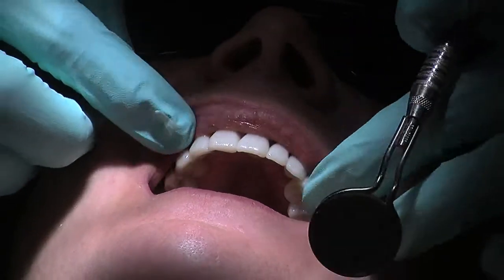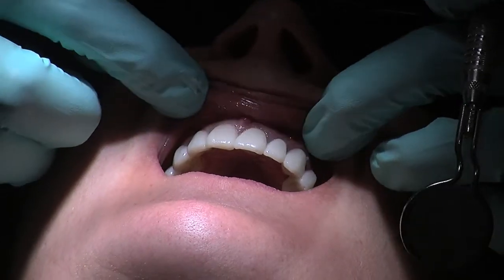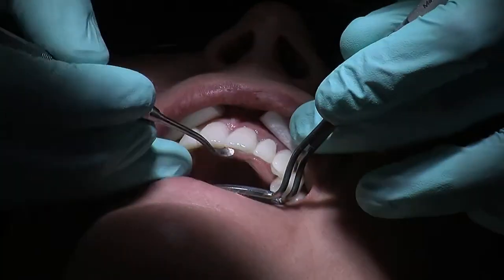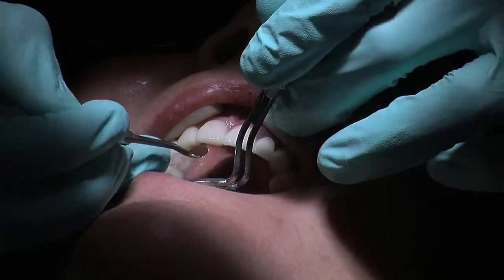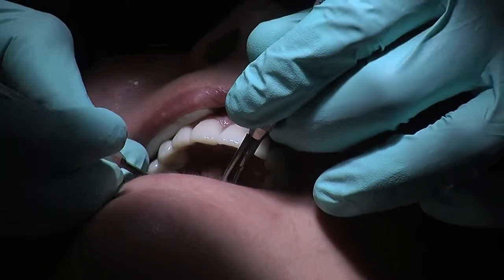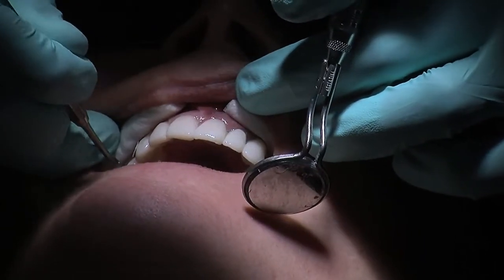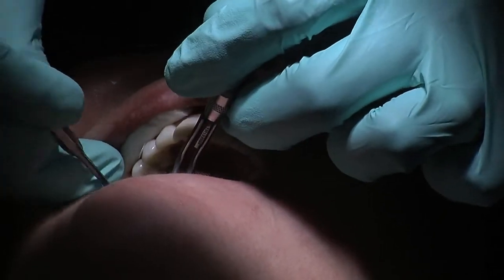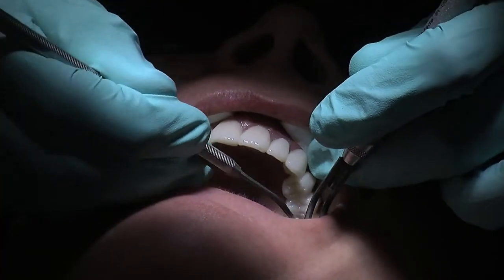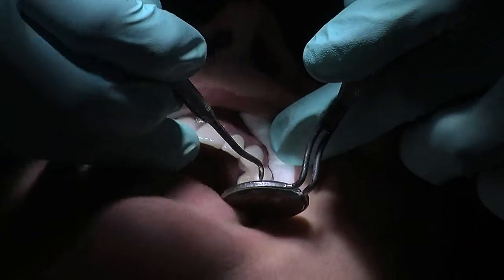Wax ups were excellent, and you can see now my work is going to be absolutely minimum finishing these off. So I've got a Mitchell's trimmer here, and I'm just going to be removing any slight bits of excess flash of the Luxatemp. And really, this is beautiful. There's very, very minimum amounts. Also, you've got to look out for the occlusal surfaces of the last teeth, the 6s. There's normally some on there, so just remember that for the occlusion checking later.